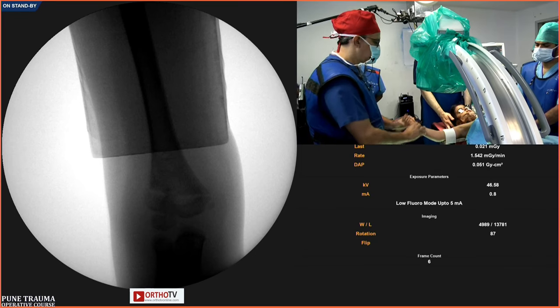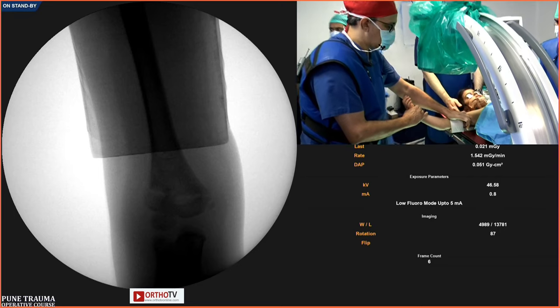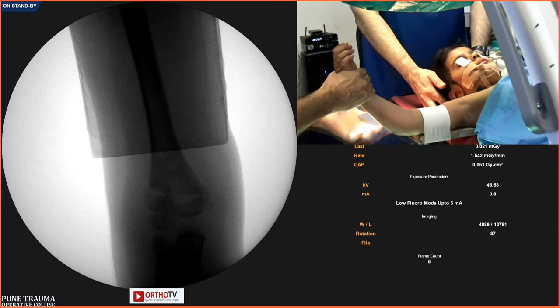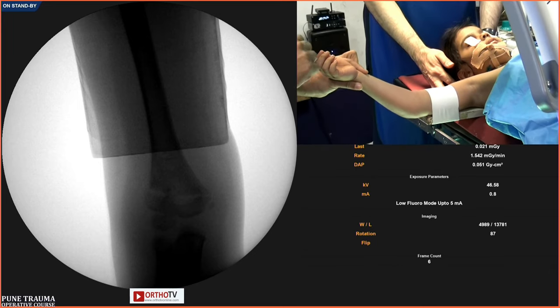We need to keep the alignment in valgus. So with a little gentle traction, I can put a little firm pressure here and give a longitudinal traction. In a type 3, if it is unstable, we do the mediolateral maneuver at this minute. Right now it looks pretty good.